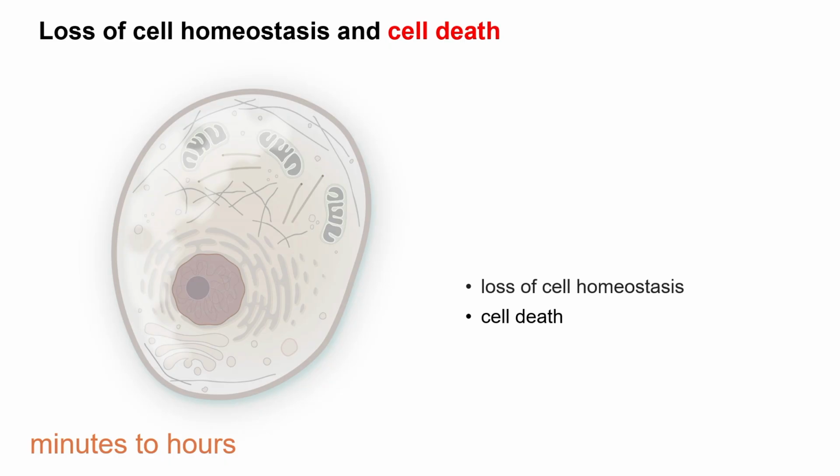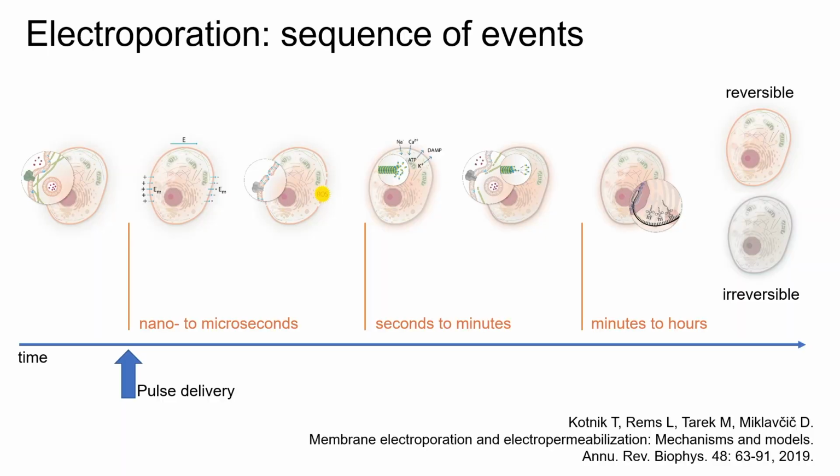So that's the basics, and that's the underlying mechanism of pulsed field ablation, the technology that we have also been enthusiastic about in the last couple of years. Note the time scale. It goes from nano to microseconds. That is during the pulses, immediately after the pulses, but it can extend to hours until we see the final results. Hence, the mapping is kind of lost, for the time being.